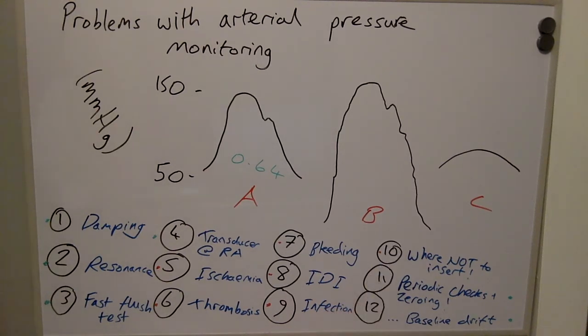and we need to be cautious where not to insert arterial lines. And this would include at sites where there is a suggestion of infection at the skin, or sites where there is trauma.